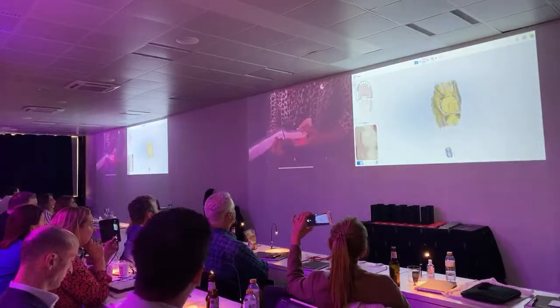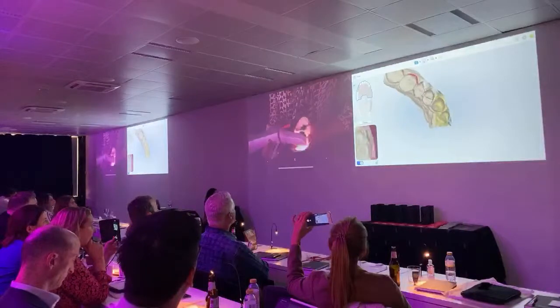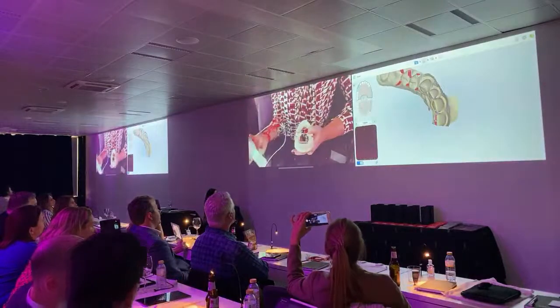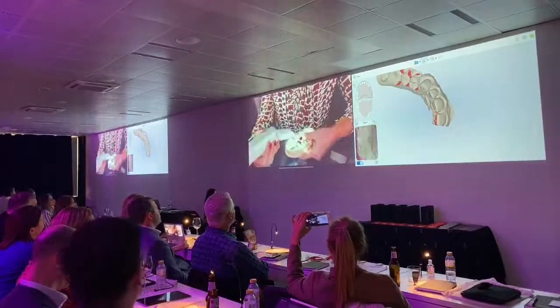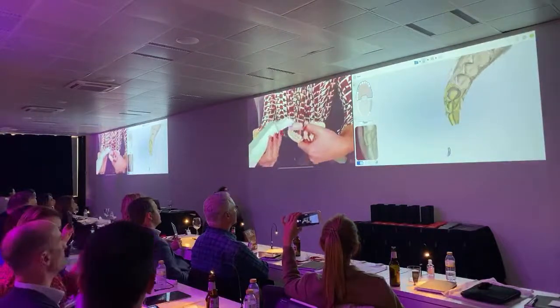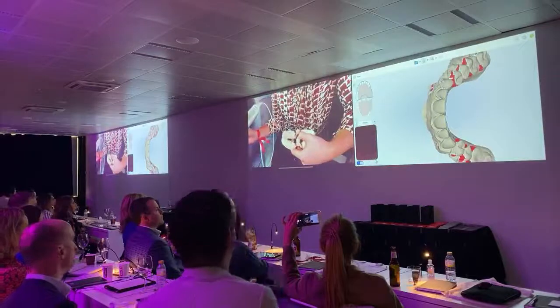Then you start again, occlusion. When you go to the canine, you start moving your camera anterior palatal until the middle of the arch, and then you stop. You turn off the camera, and then you turn on again in the other side, and go occlusion, buccal, palatal, and the software gets the images together.